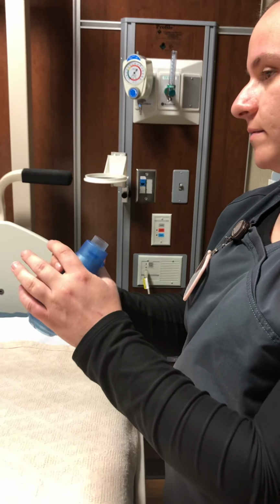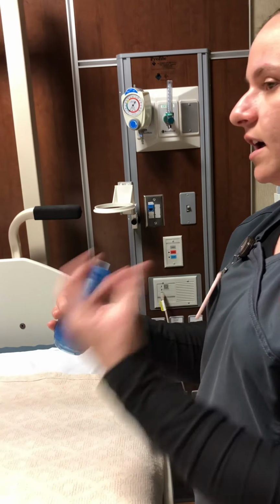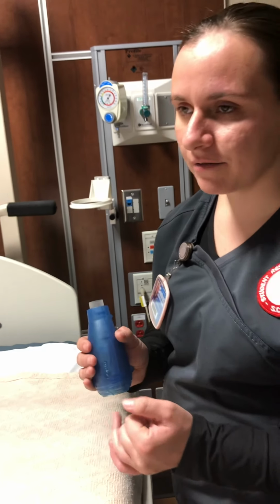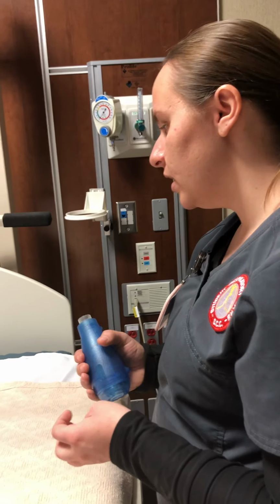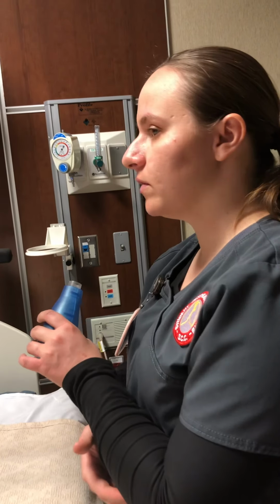So you want to hold it kind of like a microphone, okay? You're going to hold it like you're going to sing here, and we're going to take a deep breath in, and then we're going to exhale for about 3 to 4 seconds. For a patient, you want to have an I:E ratio of 1 to 3 or 1 to 4. Alright, if you feel any dizziness or anything like that, please let me know. That way we can take a break, and we don't want to overwhelm you with this. Don't want to overwhelm your lungs like that.